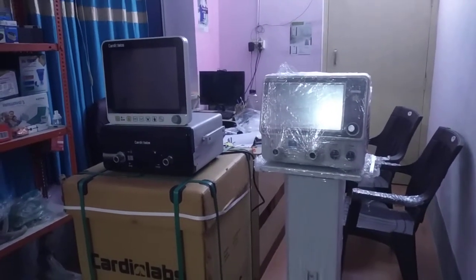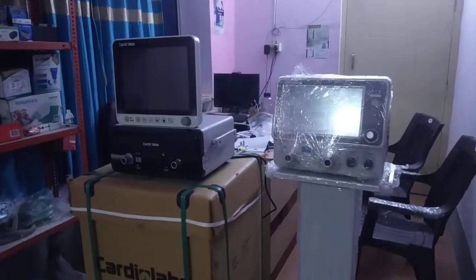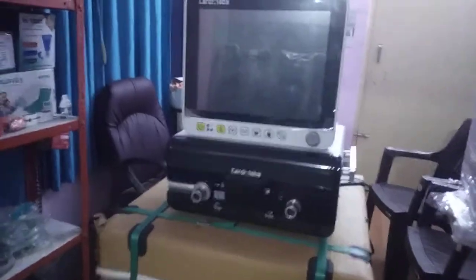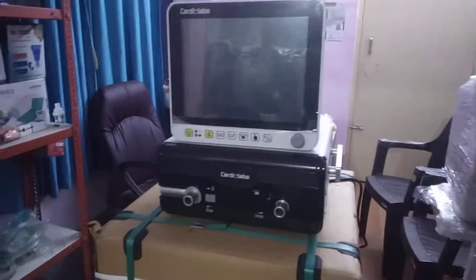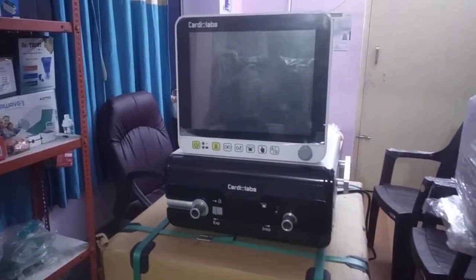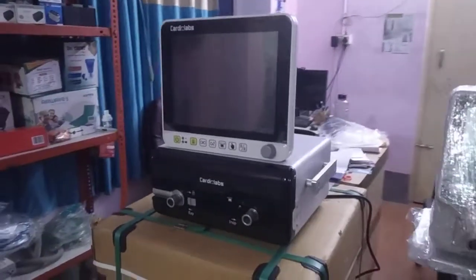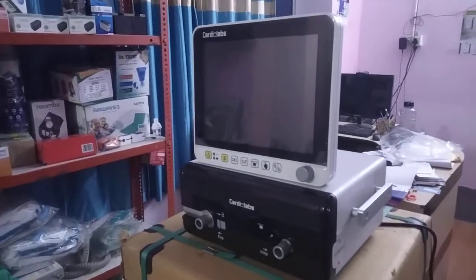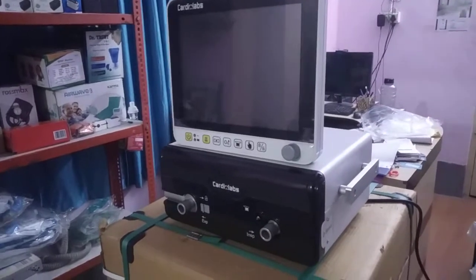Hi dear doctor friends and partners, this is Samar Das from the Ventilator Man. Today I'm going to show you the basic features of the Cardio Lab C Vent 1200T ventilator. Cardio Lab is a company from Chandigarh and they manufacture these ventilators. I believe that Indian manufacturing ventilators are as good as any US or German ventilator.